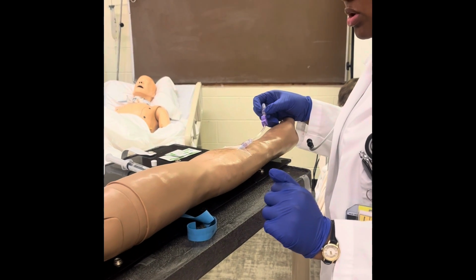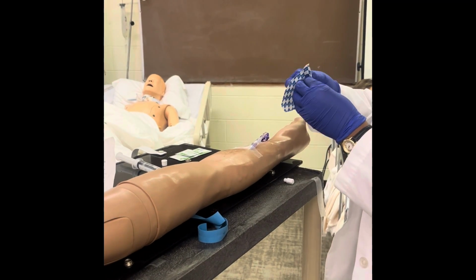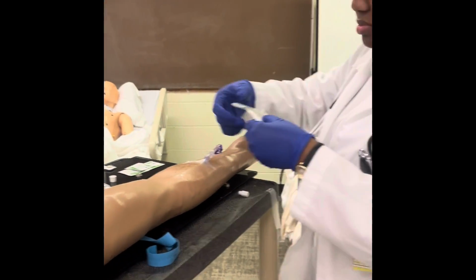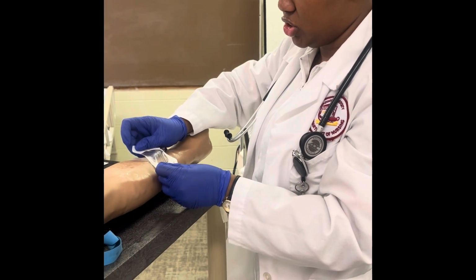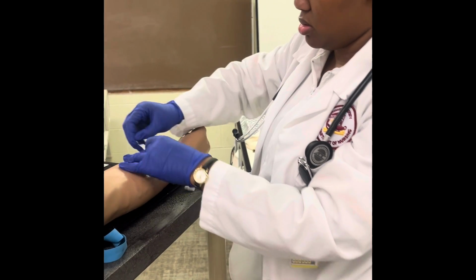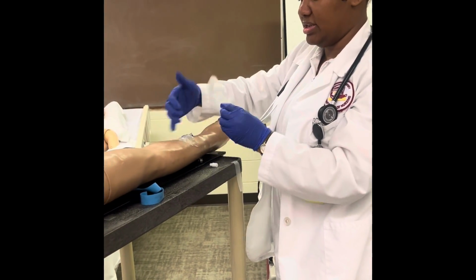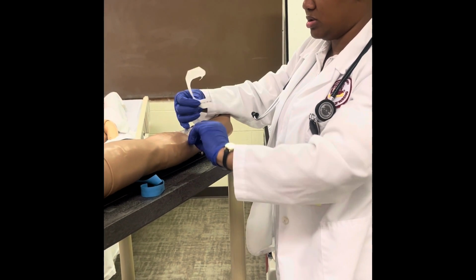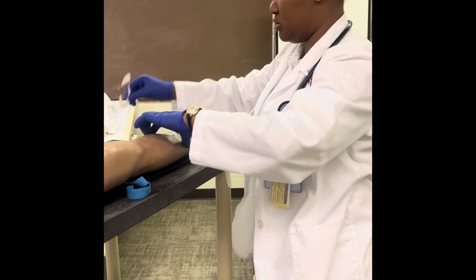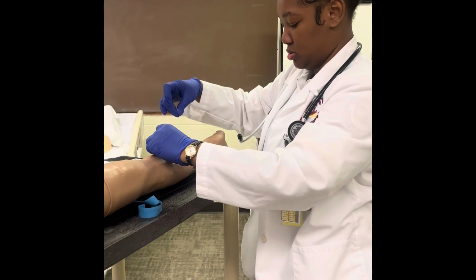Now I'm going to apply my bandage. Make sure to secure the IV down. And then there's a little sticker that comes on most of these that I can save, so I can initial, date and time it, so the next person, the next nurse on shift, can know when it needs to be changed. Now I'm going to take this up in a J shape.